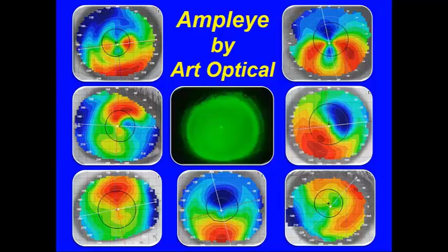Mike, you can fill us in on what's available in the smaller lens designs. Well, right now we're able to get down to 16 millimeters. I know that in the near future we'll probably be able to get down to 15 millimeters with this lens. I'm not sure we're going to be able to get smaller than 15, but we will also have the quadrant control if we need a little bit more lift for that area as well. Absolutely, yes, exactly.